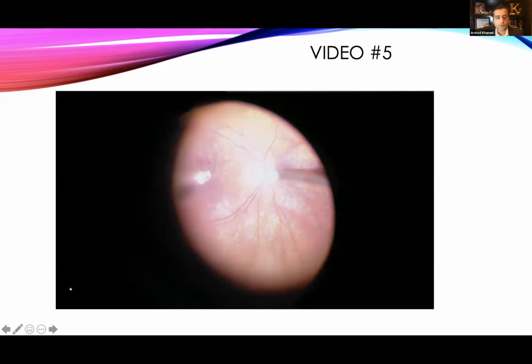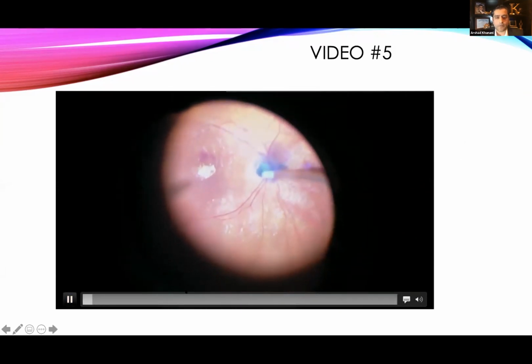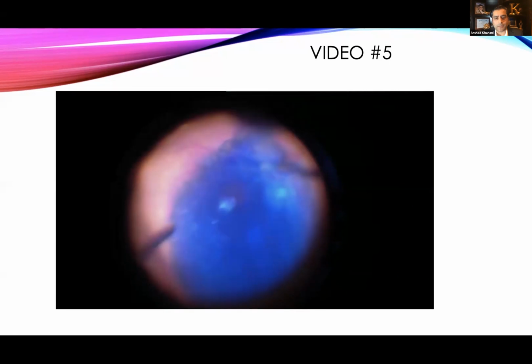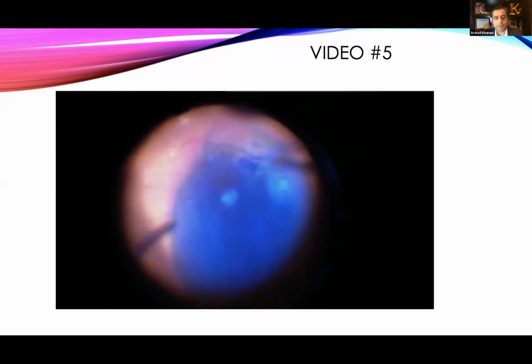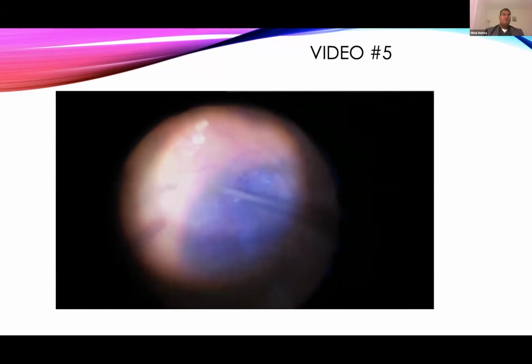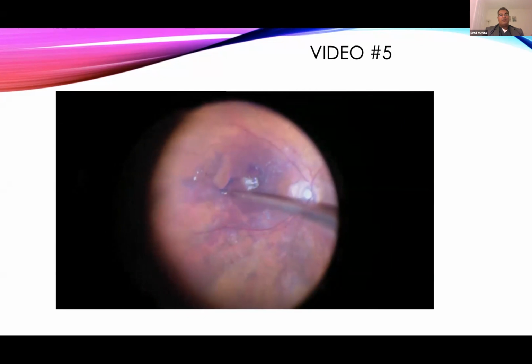Great. Mitul, this is your case, I believe. So tell us about your other fellow or the same fellow doing the case. And you're pretty close to the macula there. And I know Carl made that comment when we were reviewing the video. Are you okay with that? Yeah, this was before a fellow who shall remain nameless may have had a complication from being too close to the macula during their injections.